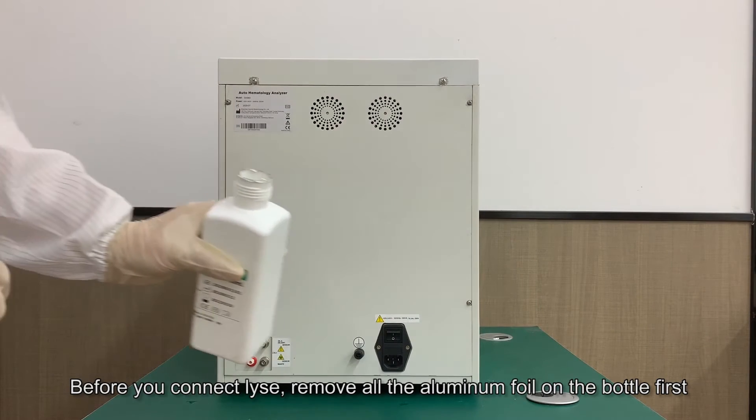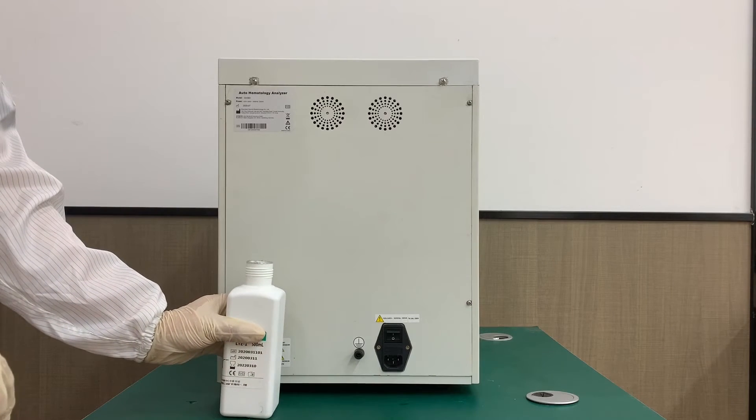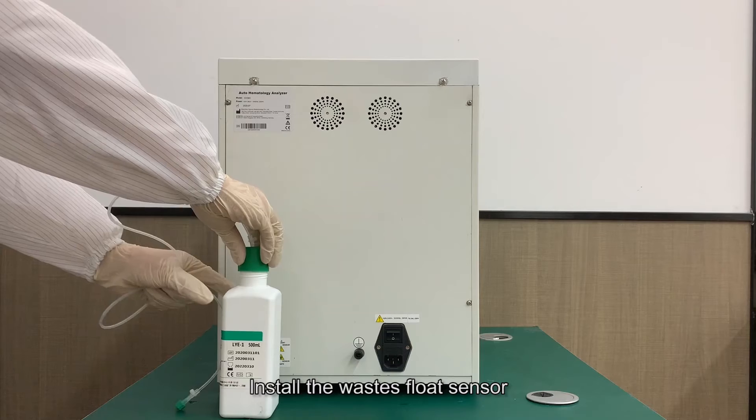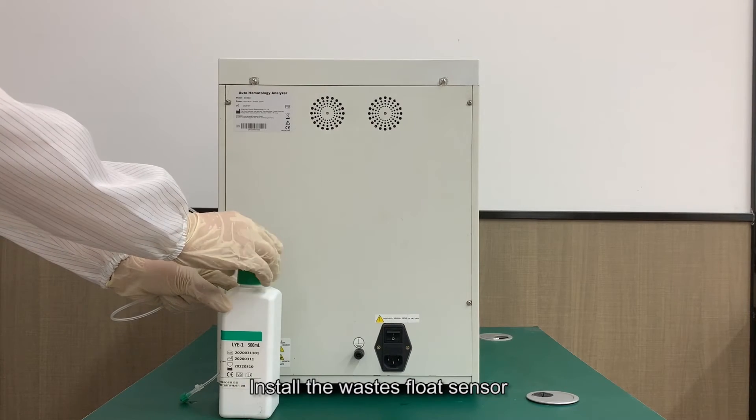Before you connect lyse, remove all the aluminum foil on the bottle first. The cap of the reagent bottle shouldn't be screwed too tight, otherwise the reagent cannot be aspirated.